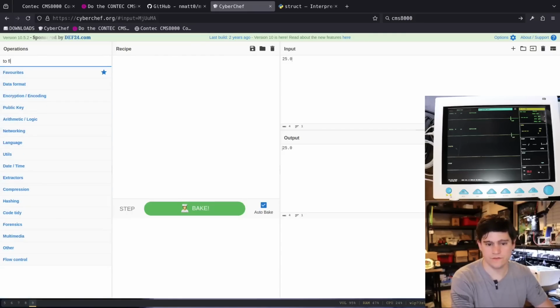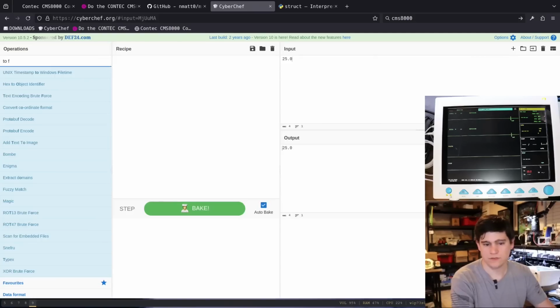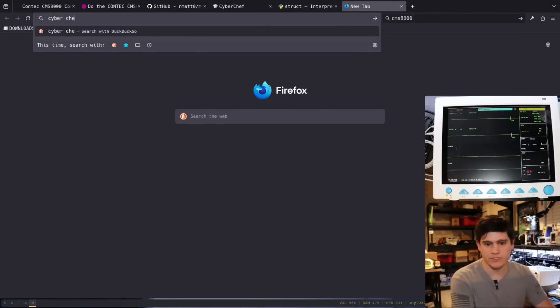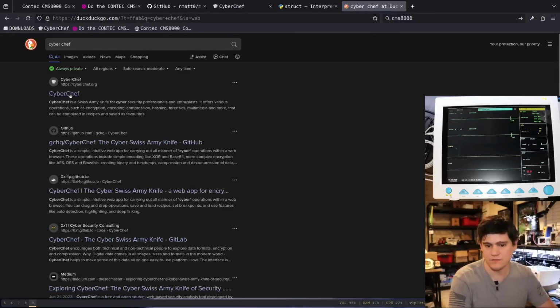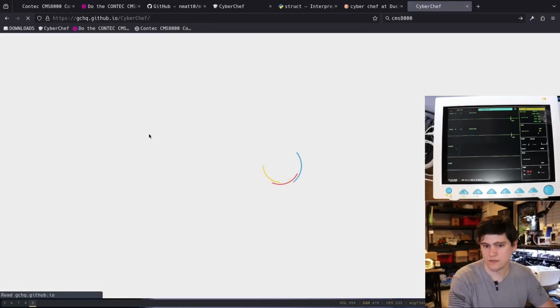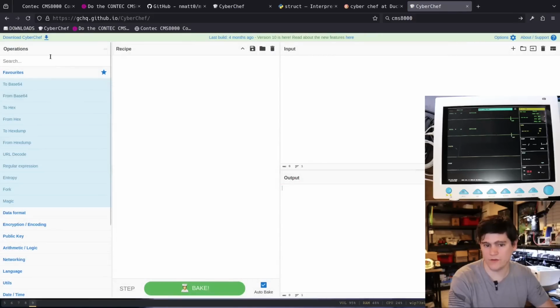To float. Okay, this is really funny because I just switched to a different CyberChef and it's not acting the same way. That's so dumb. CyberChef, because, let's use this one. Who wants my data? Yay. Oh, this is the one that works.